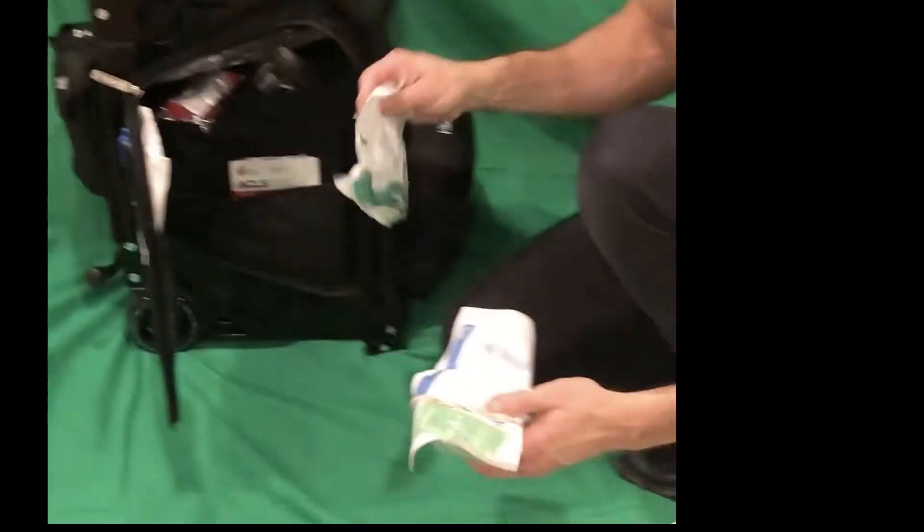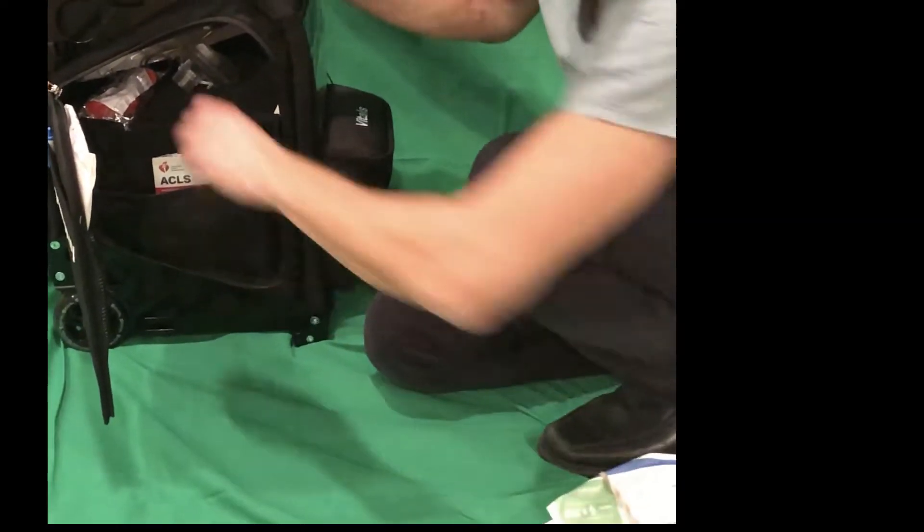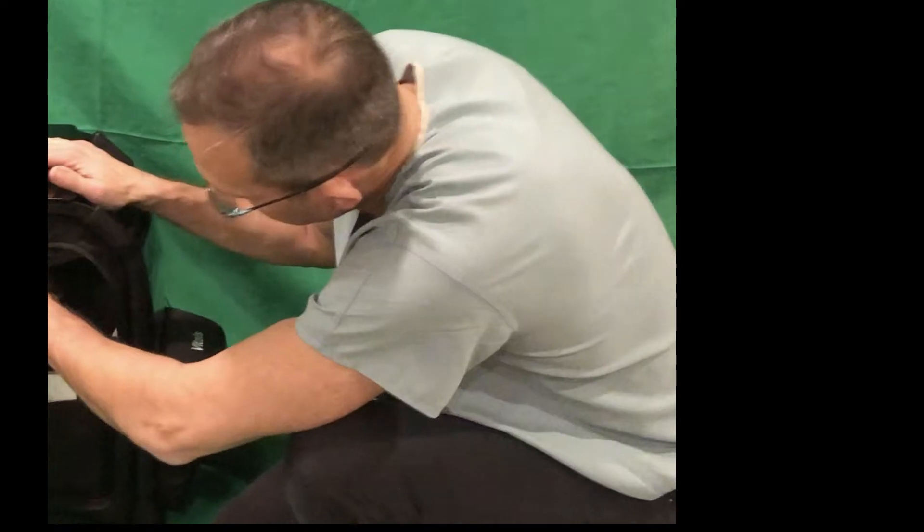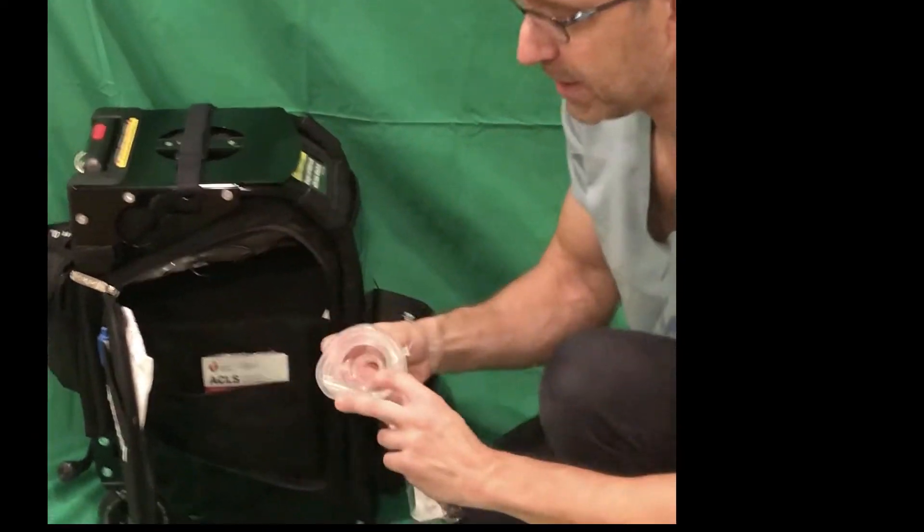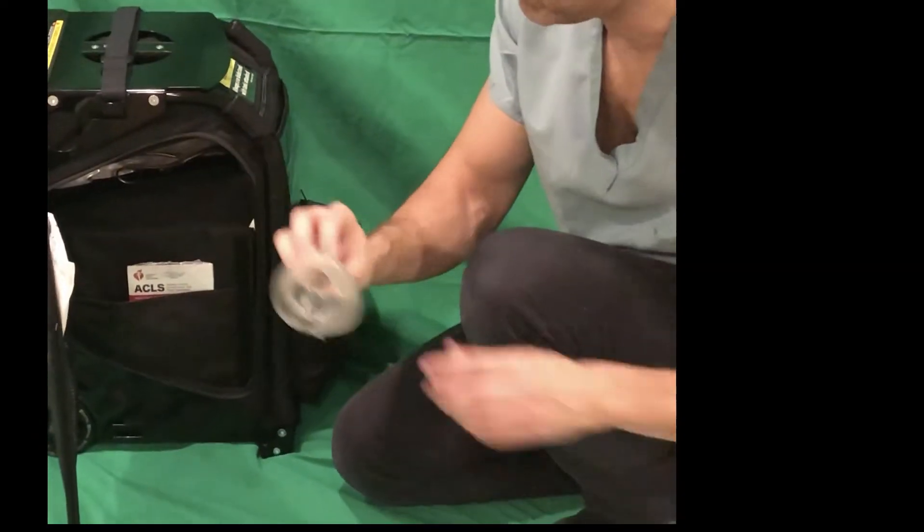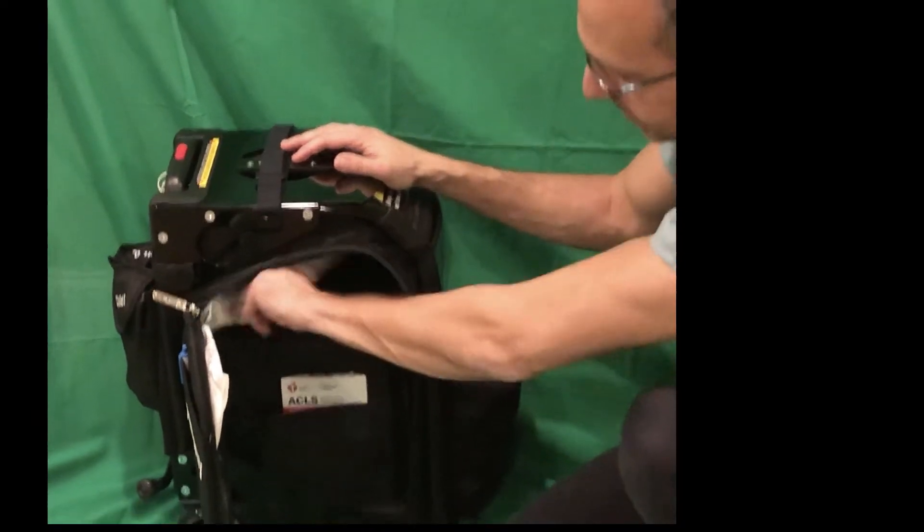There are other LMA sizes available. There is also a smaller pediatric mask if we are trying to ventilate for a pediatric patient.